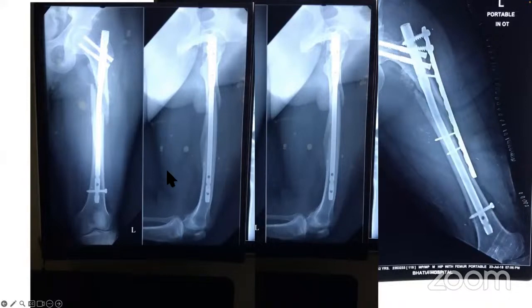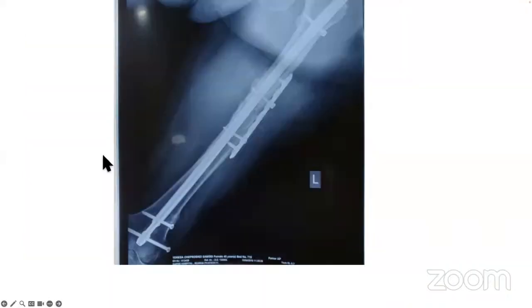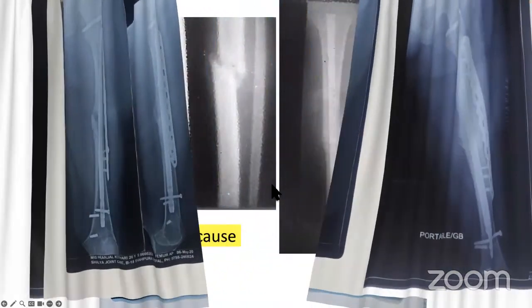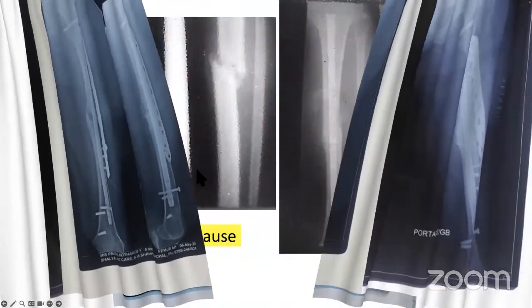So if you are in doubt at the end of the surgery like this, where the oblique fracture is going to have movement on and on, it's much safer to put in an adjuvant plate here. All these are the ones which work when there is a non-union; the adjuvant plate works all the time, as you can see very well. Now I'll talk about the tibia.